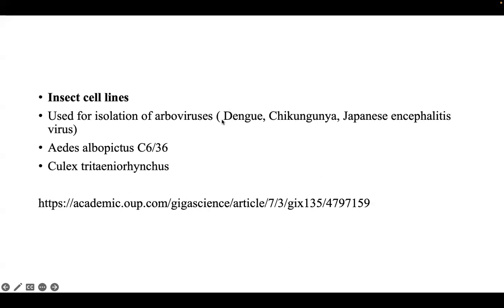And we all know the route of entry for coronaviruses is through the oropharynx, right? So that's why the tracheal rings become the organ of choice for the coronaviruses.